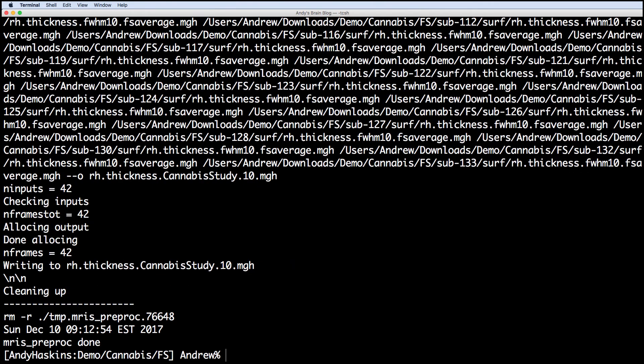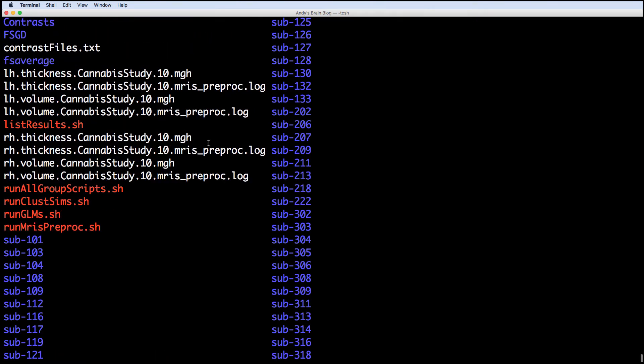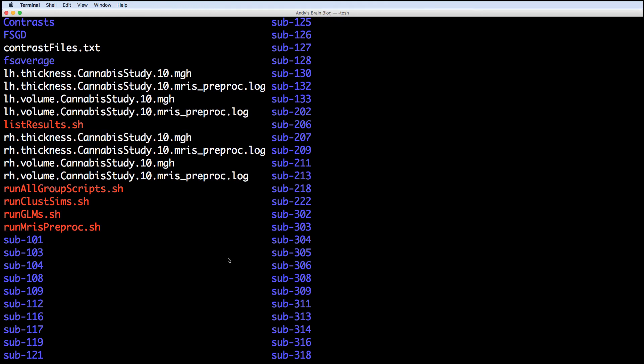The output is an MGH file, one per hemisphere and per structural measurement, along with a log file for debugging.